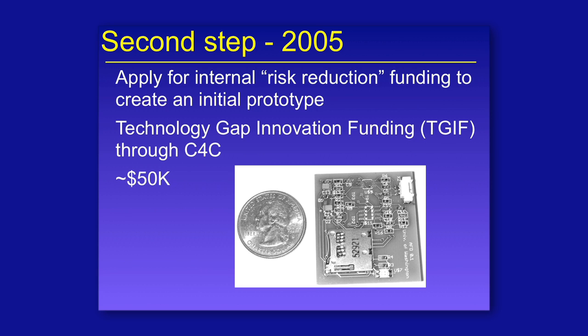And this was actually the first prototype. If you look over on the side, it says AFD 0.1, atrial fibrillation detection 0.1, University of Washington. I designed the electronics and the layout. And so this showed that it could work. This was a 1-month, one-channel device that recorded the electrocardiogram.